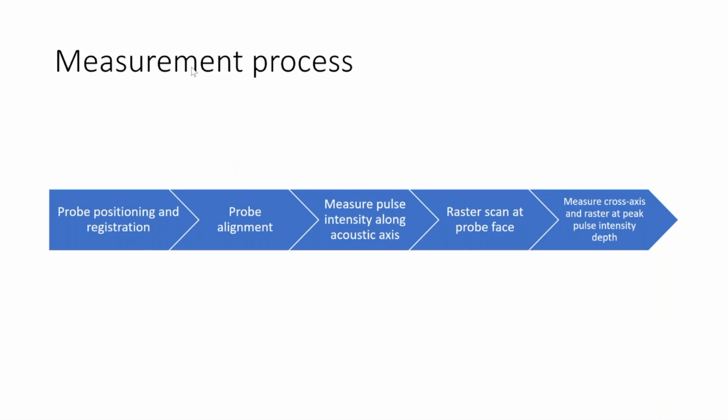So the next question is, it says, when passing through considerable fluid paths, such as the bladder or amniotic fluid, the derating allowance would be inappropriate, and one could have an MI greater than 1.9 despite display level less than this. And in theory that is true.